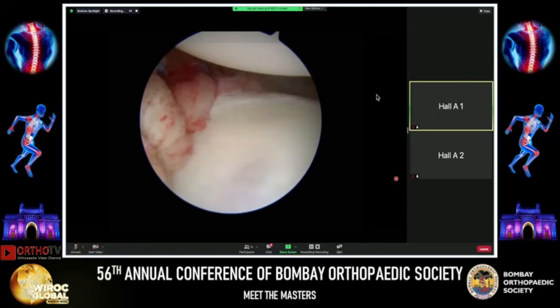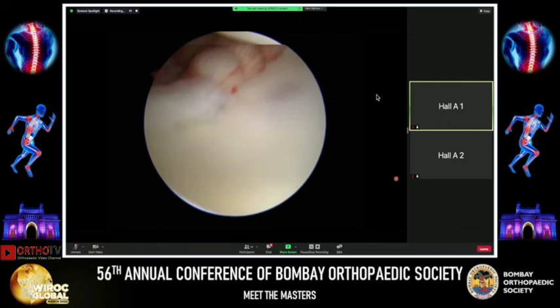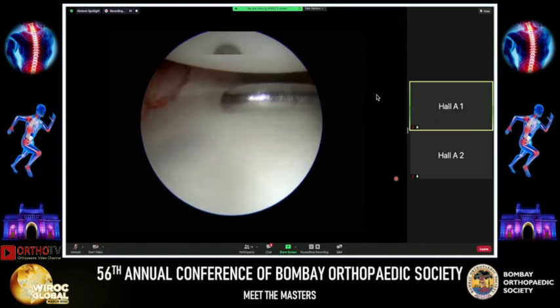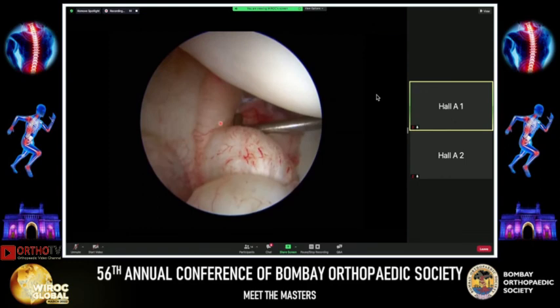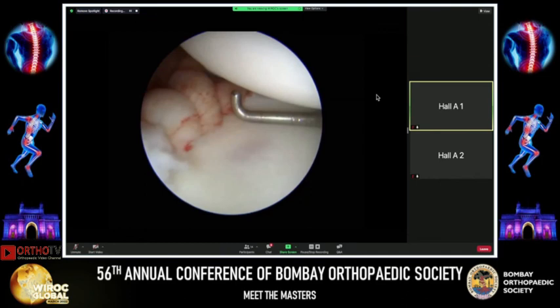The procedure is now complete. A good labral bumper has been recreated, indicating that a capsular shift was also performed. This labral bumper restores the concavity compression effect, converting the flat glenoid — like a saucer — into a cup. There is now a contiguous labrum from posterior to inferior, with good soft tissue tension: a nice labral bumper ensuring concavity compression and a taut antero-inferior glenohumeral ligament.